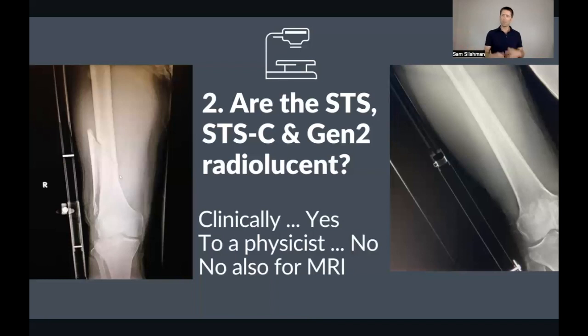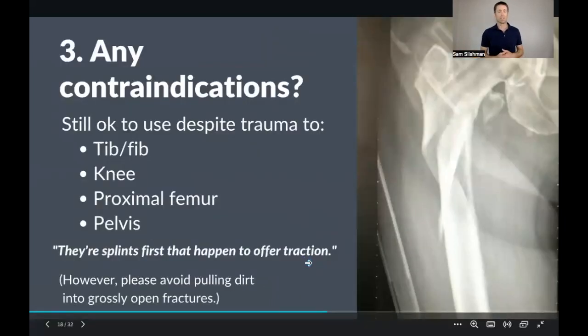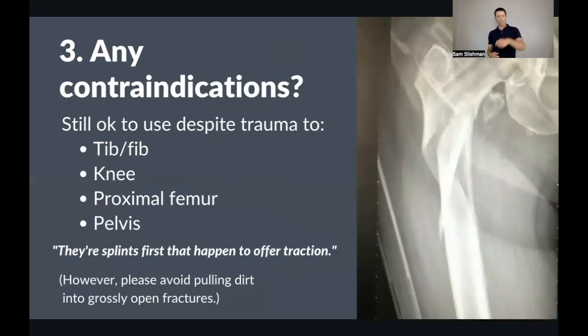Anyway, patient comes through, we do CT scans with these without a problem. All right, next point here, any contraindications? So I'm gonna go straight to my line there. These are splints first that just happen to offer traction, and you can splint anything you want.